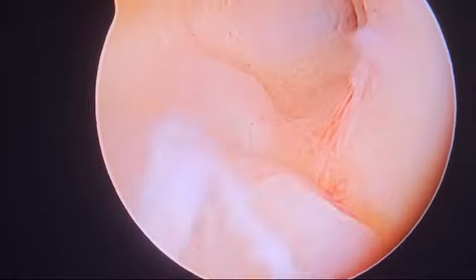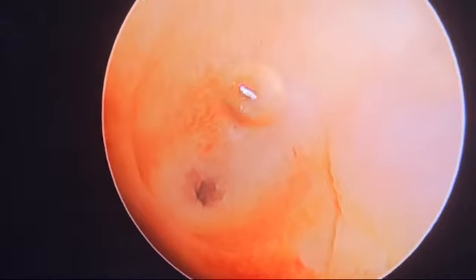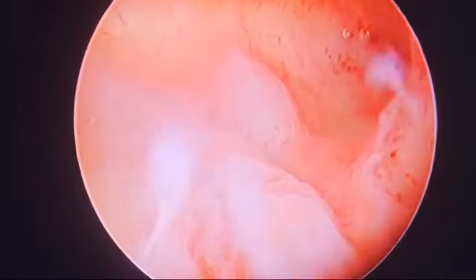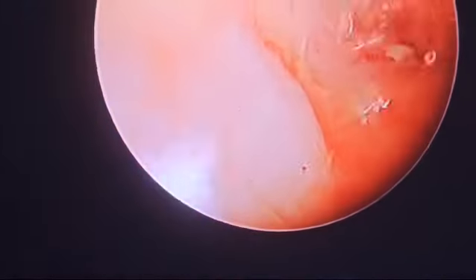Now let us check the bubble test in both tubes. We can see the bubbles are going in the right tube easily. The left tube — bubbles are not going that easily. The right tube bubbles are going with ease. So at least one tube has been opened in this case.